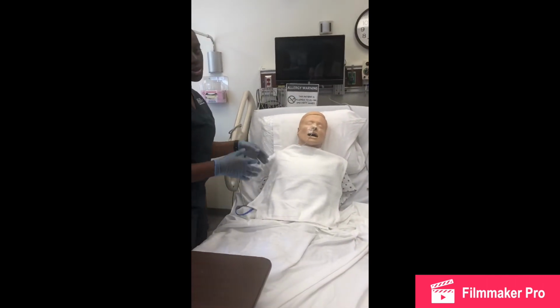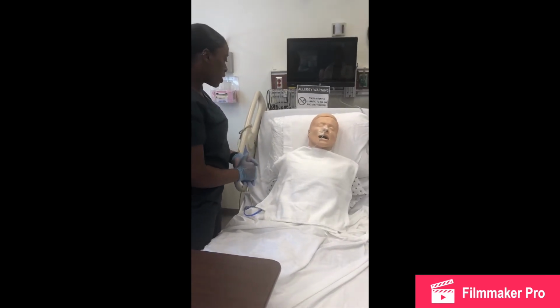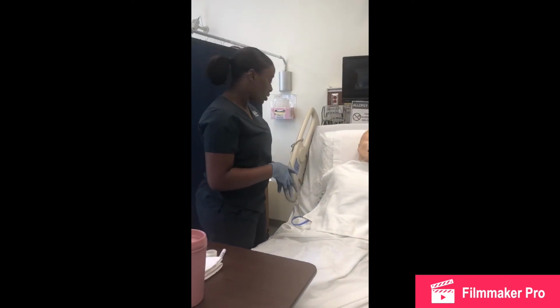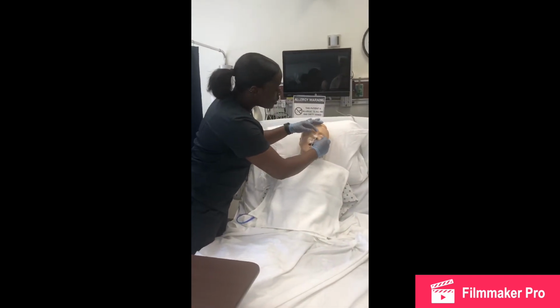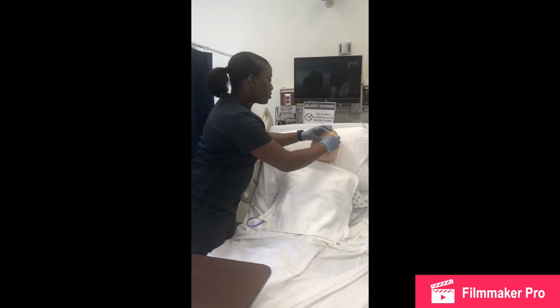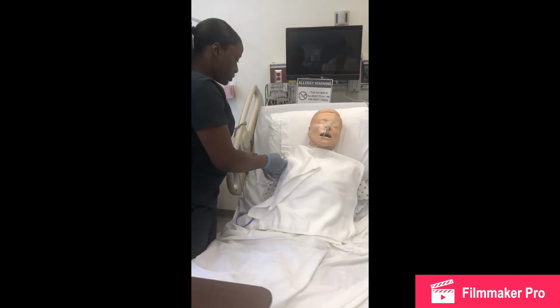I would then assess my patient to make sure that he's comfortable and not in any pain before I start the procedure. I would then check my patient's name and date of birth to make sure it's the right patient, and make sure he verbalizes that to me also. And then I will start by releasing these tapes, and also the tape on his clothes that secures the tube.